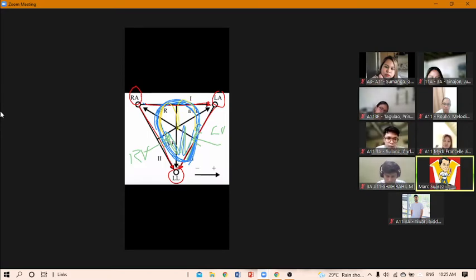You follow? Yes, Doc. Okay. Looking at this representation, we'll just imagine that the heart is here in the middle. This is the heart.